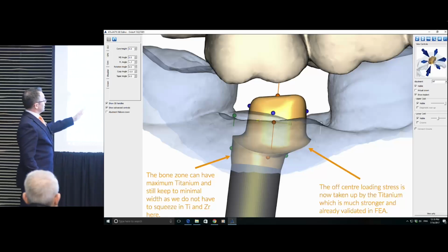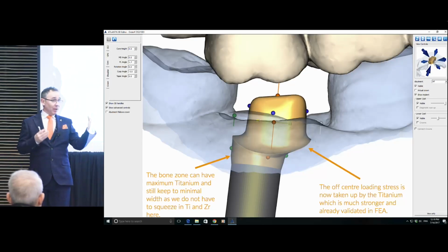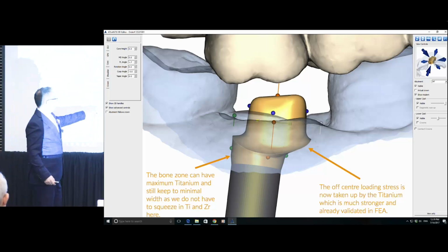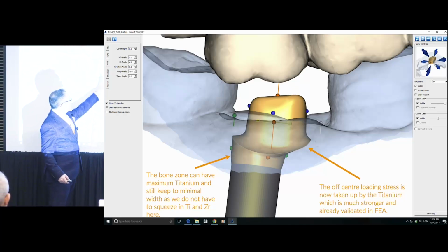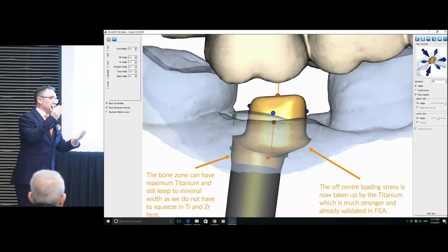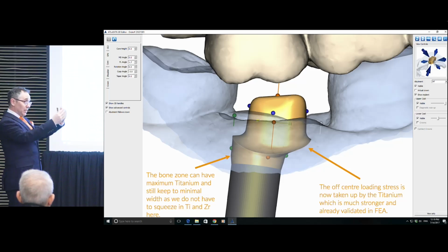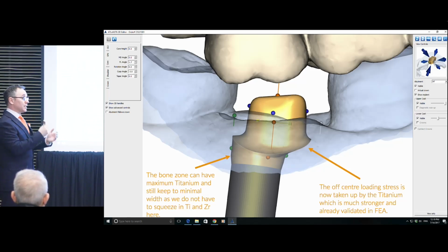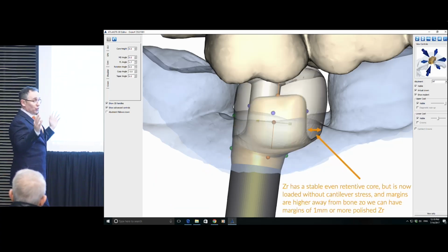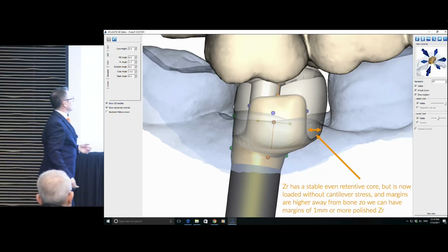Why? Because this implant here, if it had been placed as well as I'd hoped, like Martin did with his, I wouldn't have needed this. But here, they wouldn't get away with that base solution. So we're not here saying to you, it's going to be HBG for everything. Sometimes you need a custom. But luckily for us, in the Elos family, the same libraries, you can go straight to a custom. And I do this with Createch or anybody, milling companies that you like, they can use these pre-mills for you.